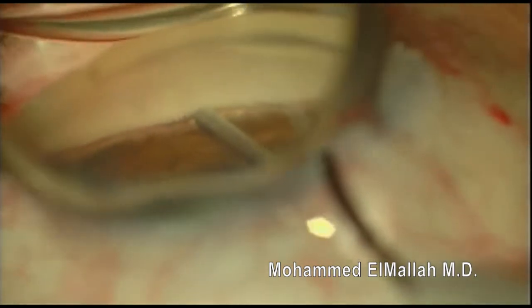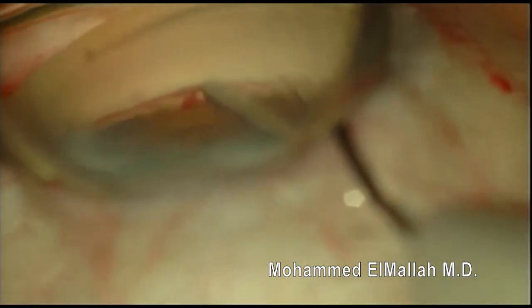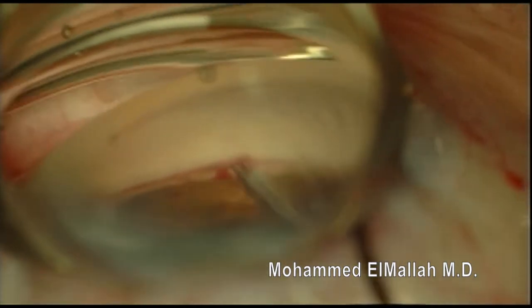You can see here that the insertion is going fairly well. The iStent looks like it's in good position. The inner wall of Schlem's canal is tenting up. However, I'm having some difficulty releasing the iStent.